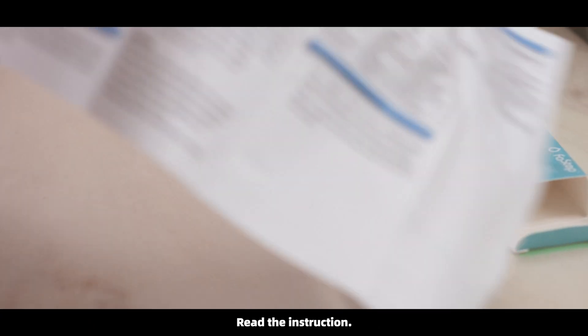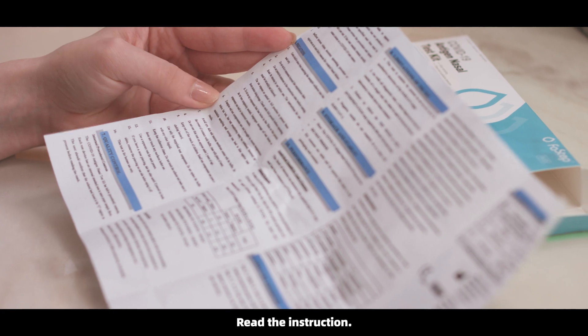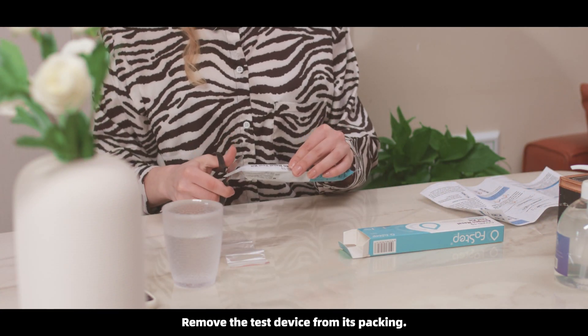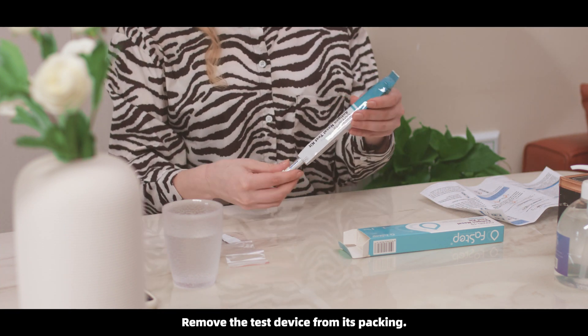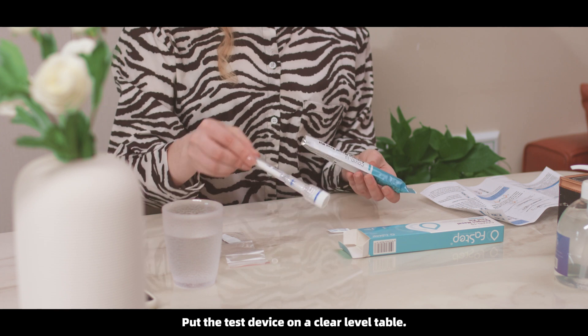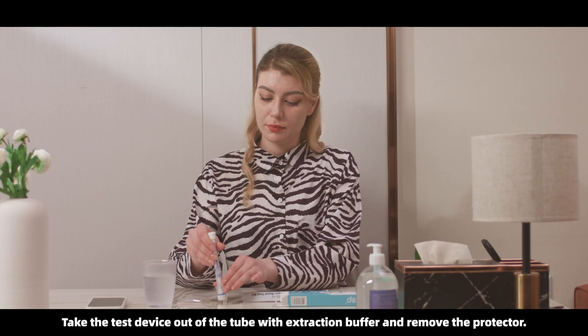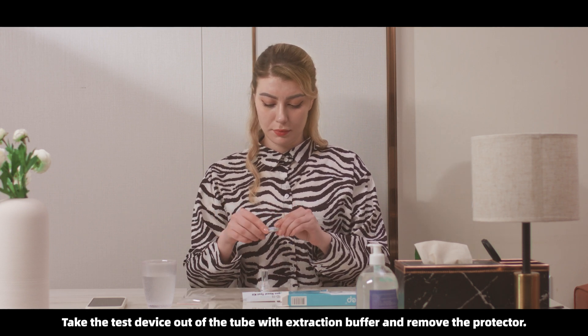Read the instruction. Remove the test device from its packaging. Put the test device on a clear, level table. Take the test device out of the tube with extraction buffer and remove the protector.